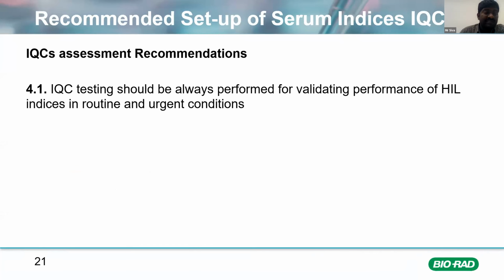Thank you. So IQC testing should always be performed for validating performance of HIL indices in routine and urgent conditions also.